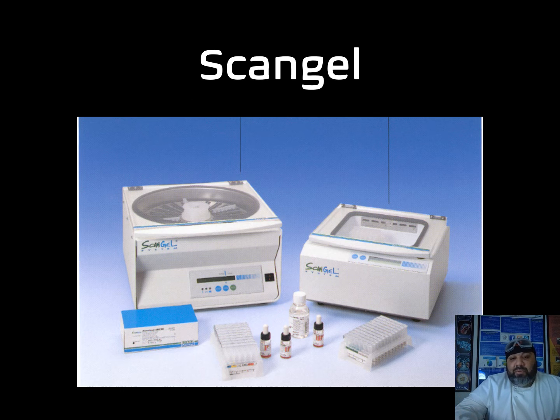ScanGel allows antibody screening, or indirect antibody screening, to be centrifuged in a very succinct manner versus, for example, blood components that are centrifuged. These are indirect screenings of antibodies that are conducted in almost pre-conditioned cards, where antibodies and components or reagents are separated out into particular segments of these cards.